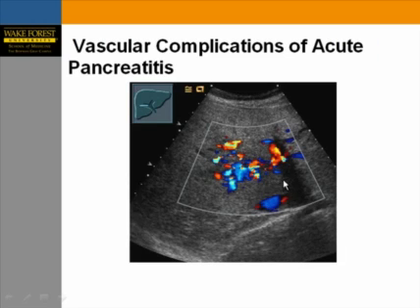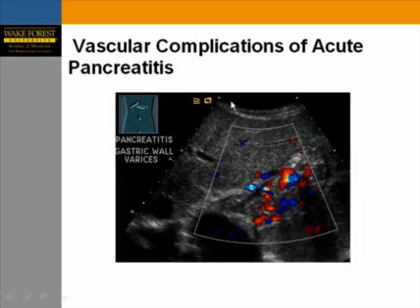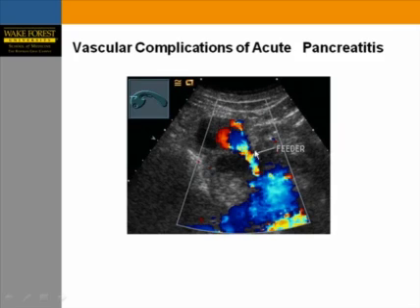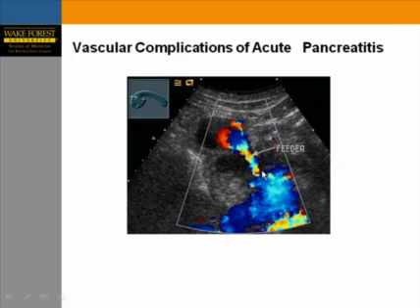This is an example of cavernous transformation of the portal vein in acute pancreatitis — chaotic vascular structures showing an organized pattern of tiny collateral veins. Another case shows multiple short gastric varices with a smooth liver surface and no signs of cirrhosis, indicating isolated splenic vein thrombosis. A further case demonstrates a large pseudoaneurysm of the gastroduodenal artery, partially thrombosed; color Doppler identifies the feeder, leading to embolization.